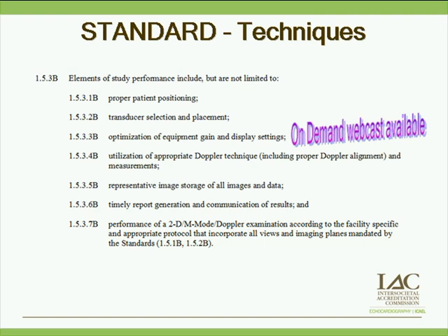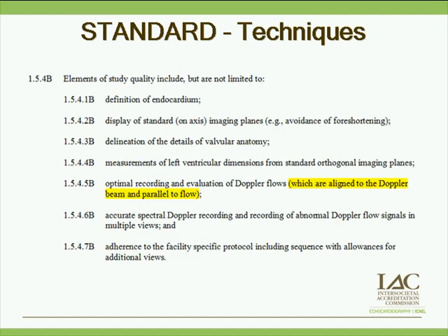Timely report generation and communication of results, and performance of the 2D M-mode Doppler exam according to the facility's specific and appropriate protocol that includes all views and imaging planes mandated by the standard. And there's also a sample document available for that.